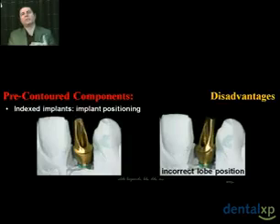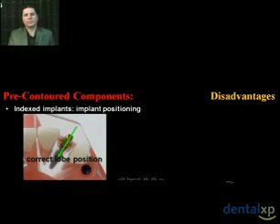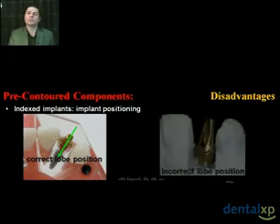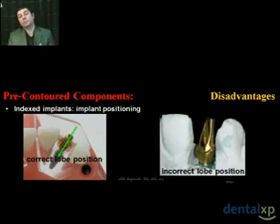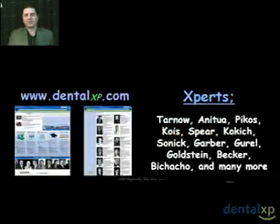Consequently, the lobe of the implant is obviously not tangent to the midfacial. What's tangent to the midfacial is a point between 2 lobes. This is a typodont example on the screen showing the correct implant position, and my clinical example from previous showing the incorrect lobe position.